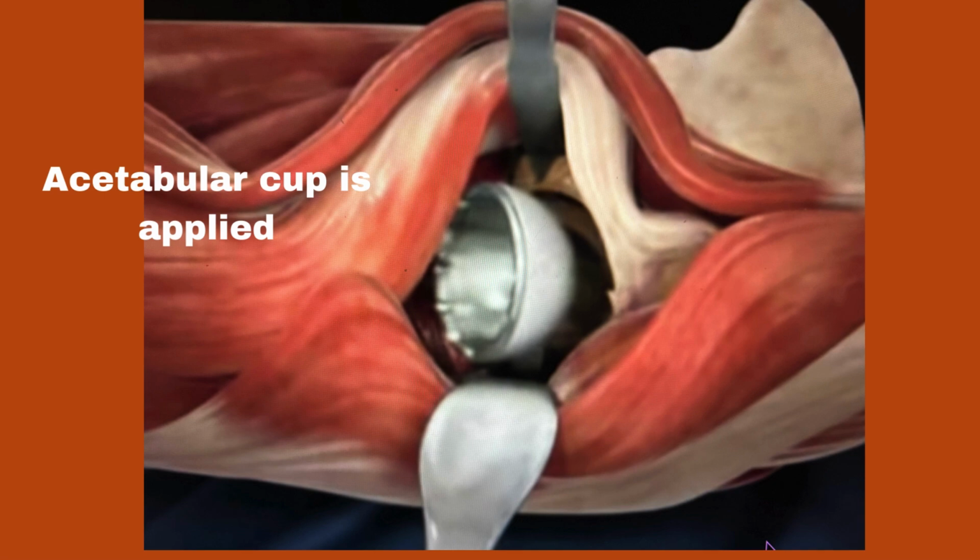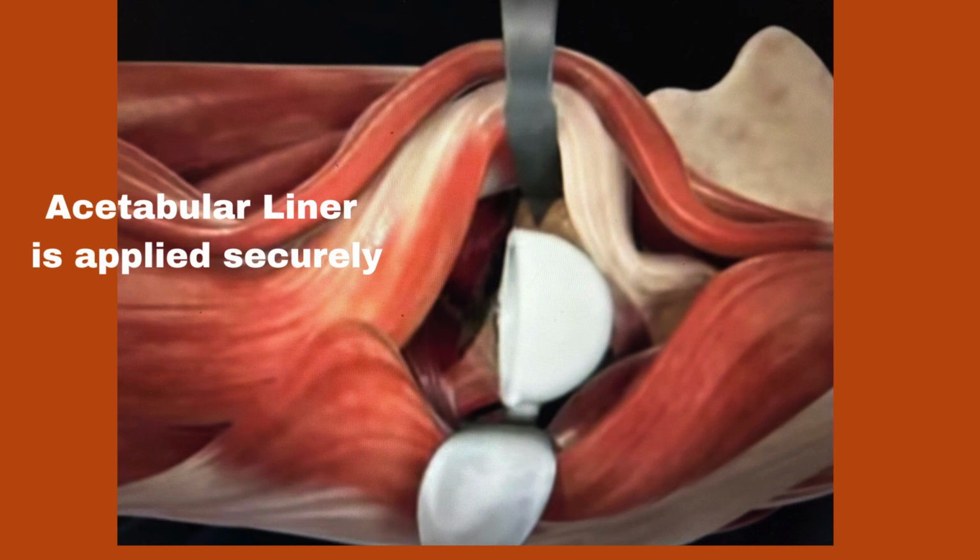This cup is often made of porous titanium metal to allow the bone to grow into it over time, or it may be attached with special bone cement. The type of cup and how it is attached to the bone depends on the surgeon's preference and the patient's physiology. The surgeon puts a rounded acetabular insert or liner inside the acetabular cup. The insert may be ceramic or plastic and will facilitate smooth movement within the new joint.